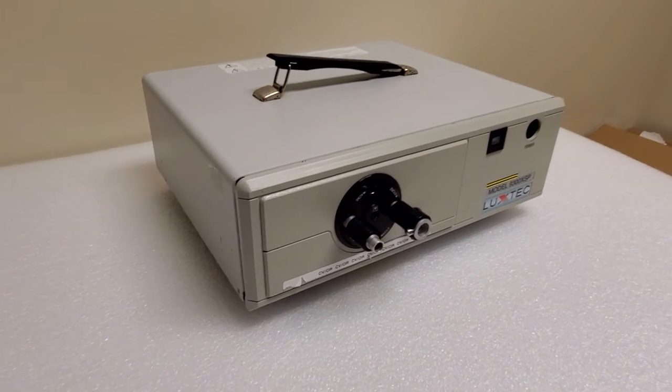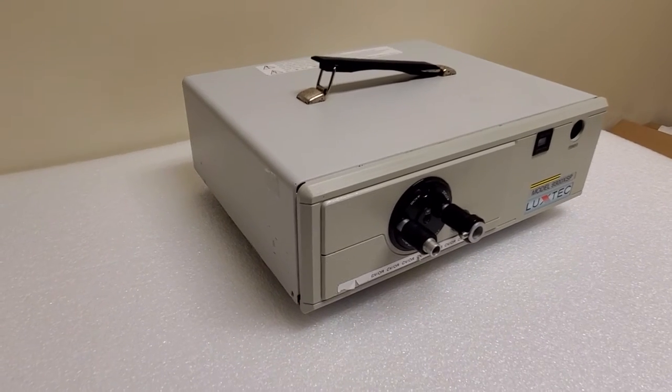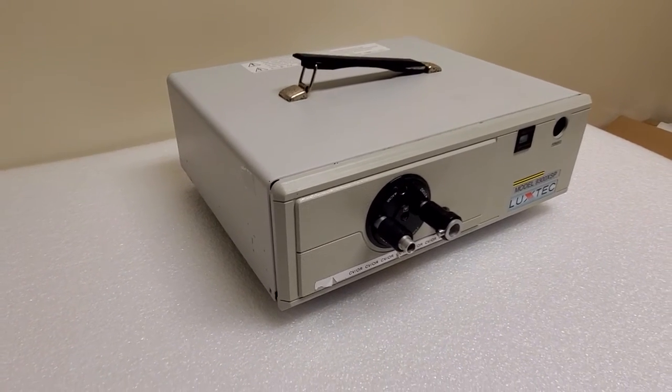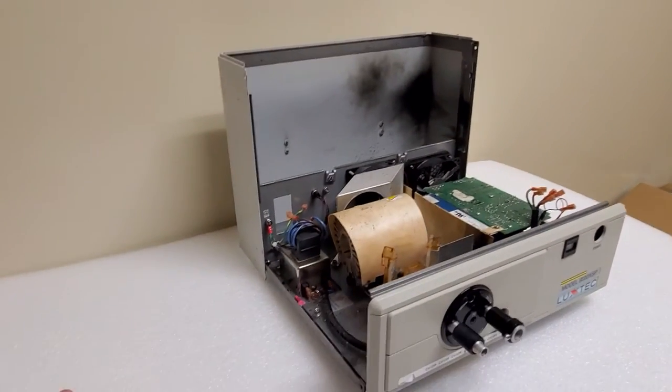Hello everyone, welcome back to A Better Biomed. Today I have something very special for you. Now this looks like your average everyday light source, but I promise you, this one is not. This one comes with included fireworks.